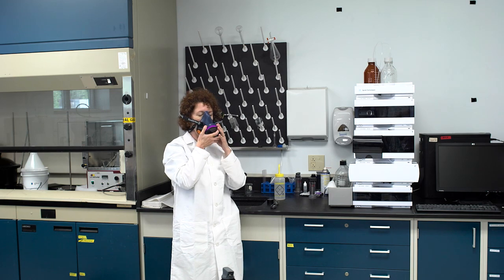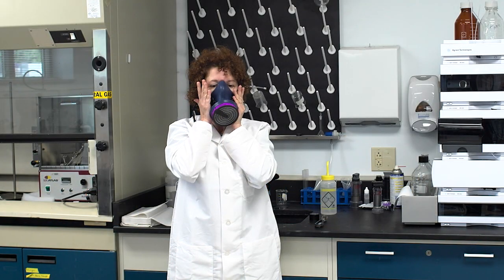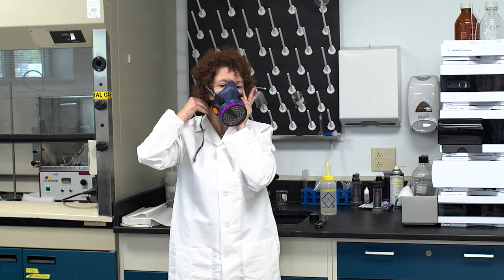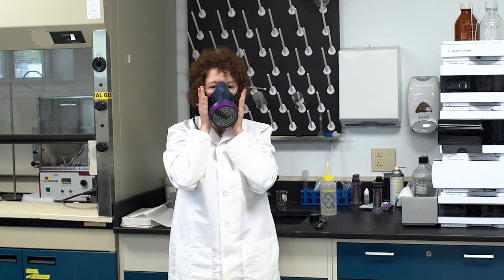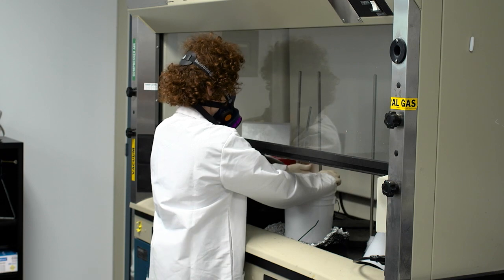Using a real-time method allows the worker to don their mask in the field, in the workplace, check for any leaks or inappropriate donning, and fix the donning if needed.